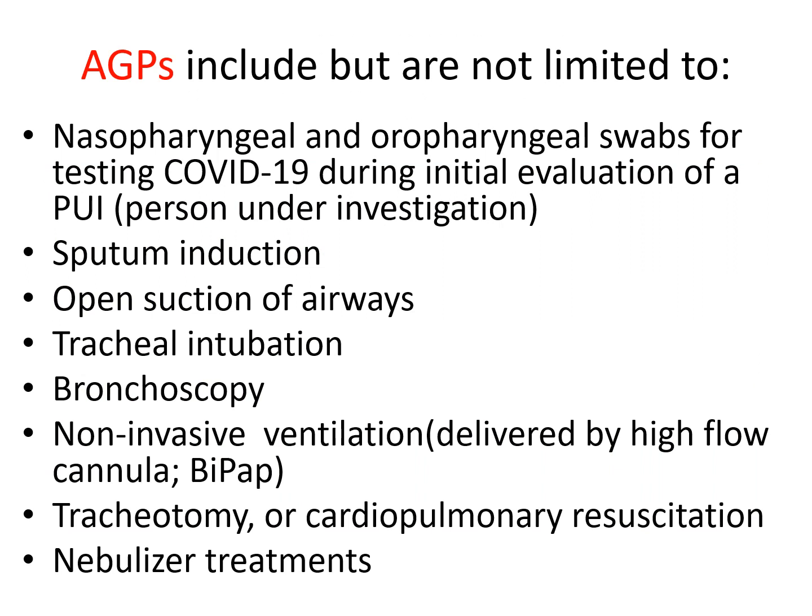Just so you understand, other aerosol generating procedures are nasopharyngeal swabbing or oropharyngeal swabbing for testing of COVID-19 during initial evaluation, sputum induction, open suction of any airways, tracheal intubation, bronchoscopy, non-invasive ventilation such as BiPAP or delivery of high flow oxygen, tracheotomy, cardiopulmonary resuscitation, and nebulizer treatments.